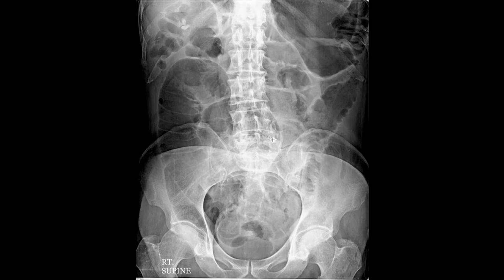Because in the supine position, things change. The gravitational force now is acting on the back, and it will let air escape upward towards the belly, towards the frontal part of the abdomen rather than the upper part of the abdomen.